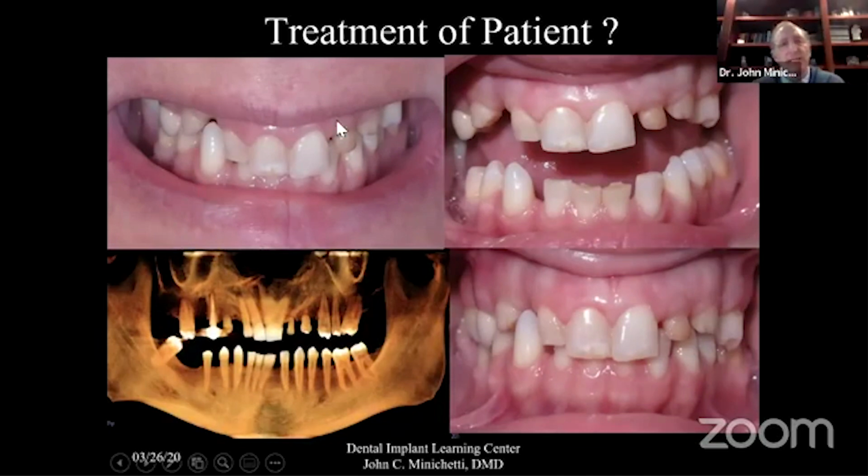And when I'm looking at this transition line, for any type of aesthetic restoration, whether it be crown and bridge or implants, if I have a gingival line that's this high in the area here of number 6, it's actually between number 6 and number 7. That's how complicated this case became. How could I possibly just put laminates or crown and bridge and have this long tooth here, unless I'm going to add pink gingiva and have a gummy smile going across?